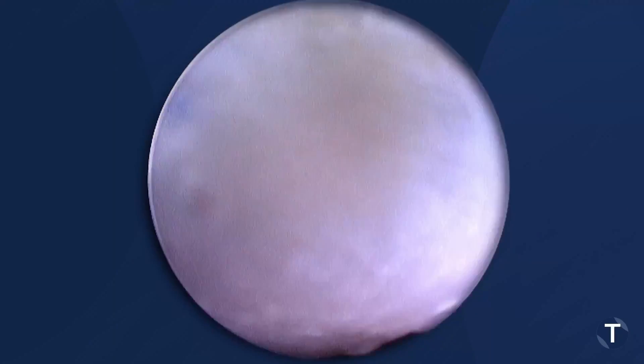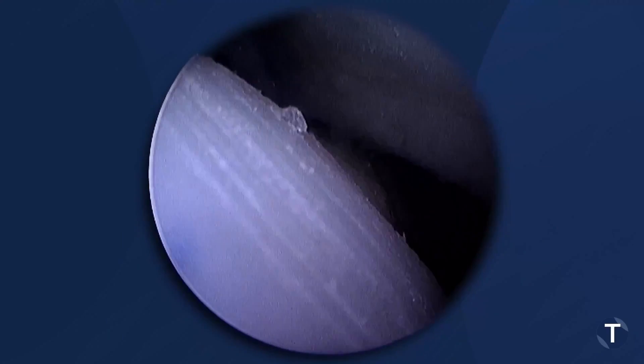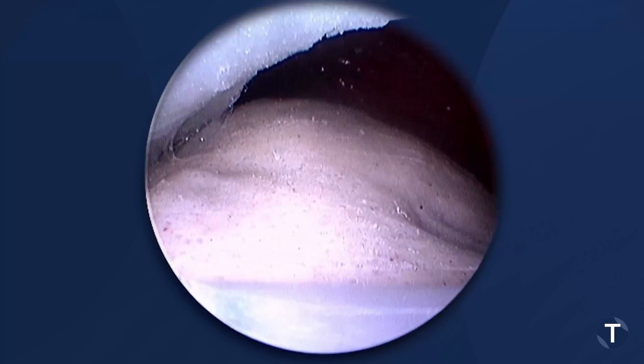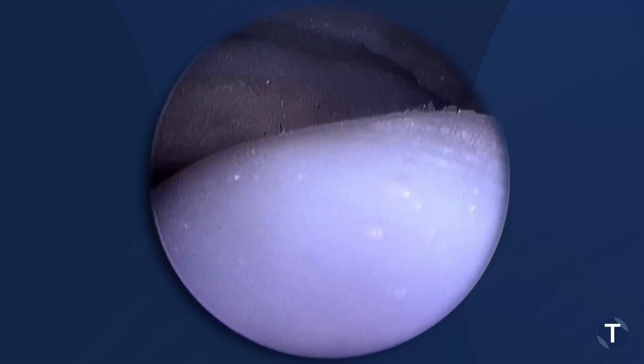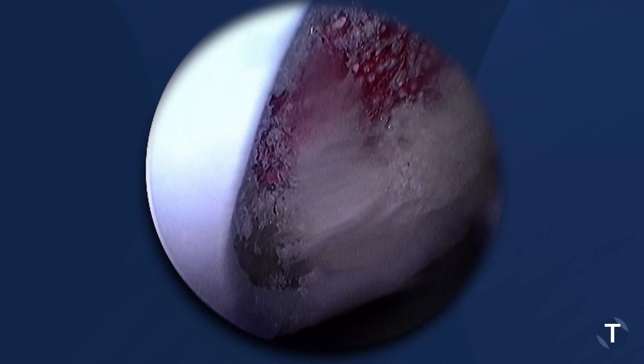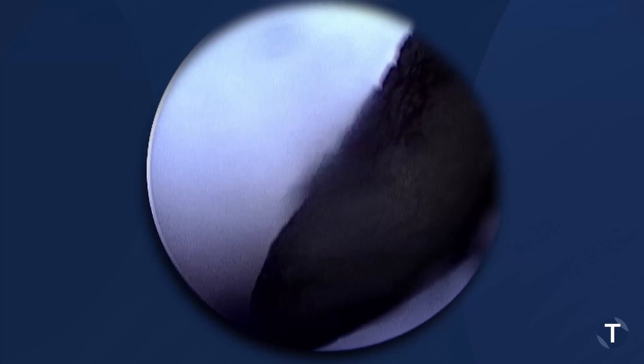We're going to look at the rotator cuff here now. There's your rotator cuff. We've already created this model — this model has a tear. You can see the exposed footprint of the supraspinatus. Inferior capsule. Our inferior labrum. And here's our Hill-Sax lesion here. You can see the exposed bone again.